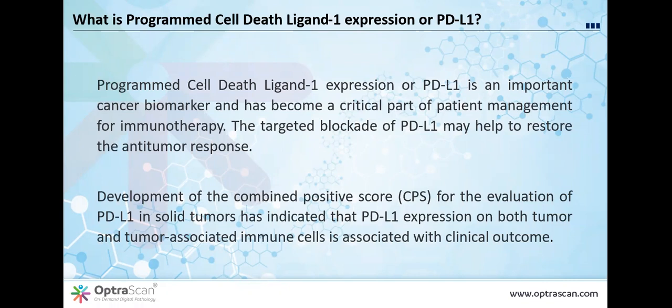The challenge for pathology was that several different antibodies were approved together with their companion diagnostic test, or sometimes a less accurate test called a complementary diagnostic test. A companion diagnostic mandates that you have to do the test in order to give the drug. A complementary diagnostic is advisory only. You do not have to do it, but it's recommended that you do, and it gives additional information.